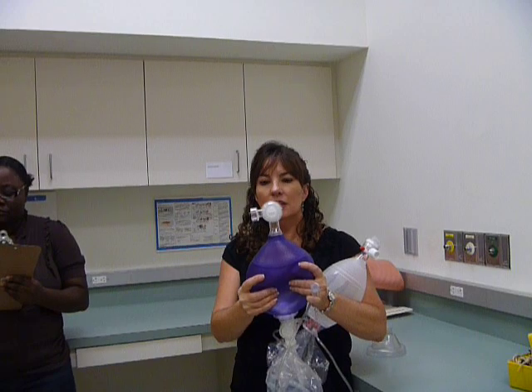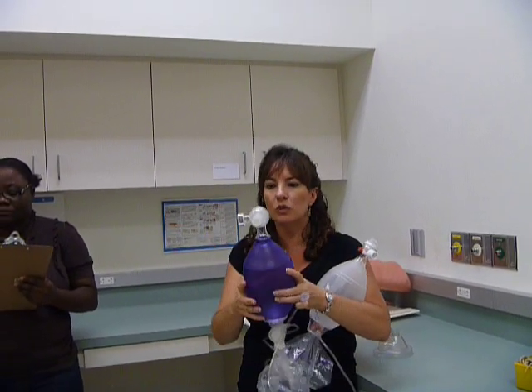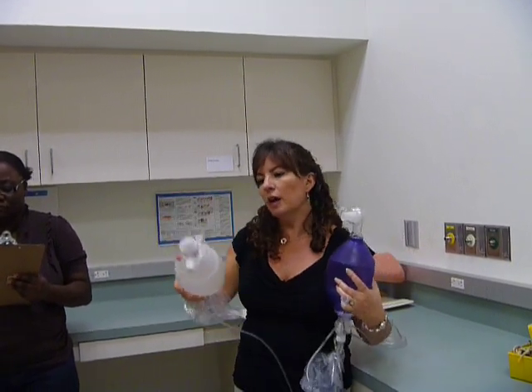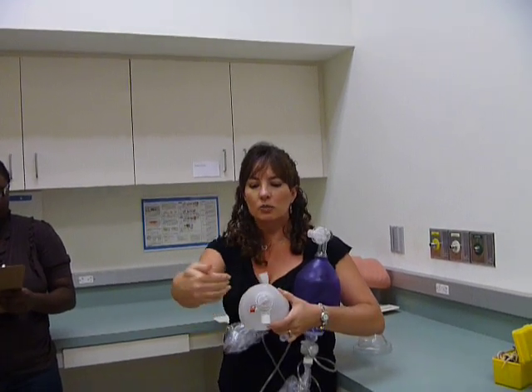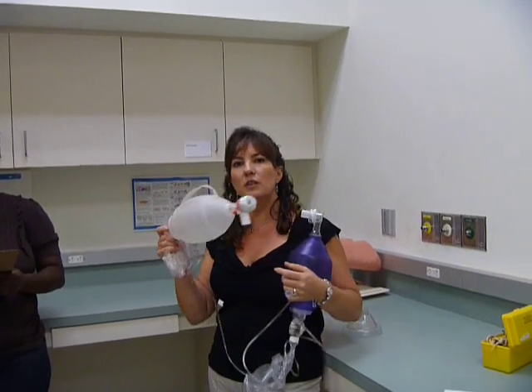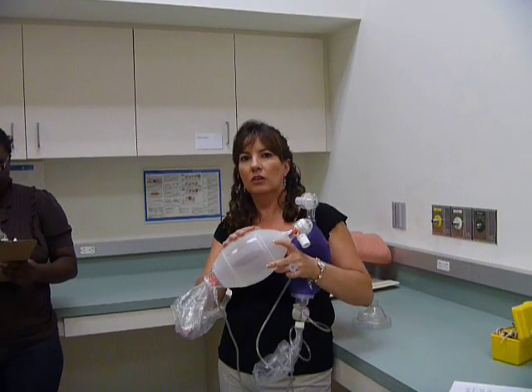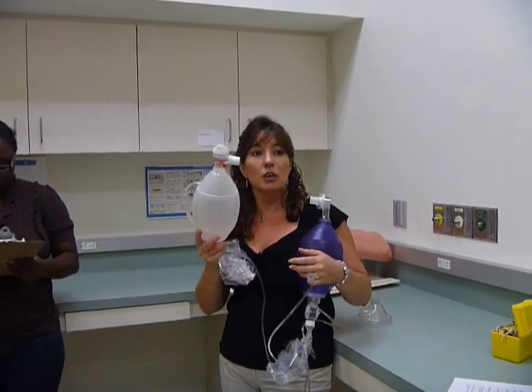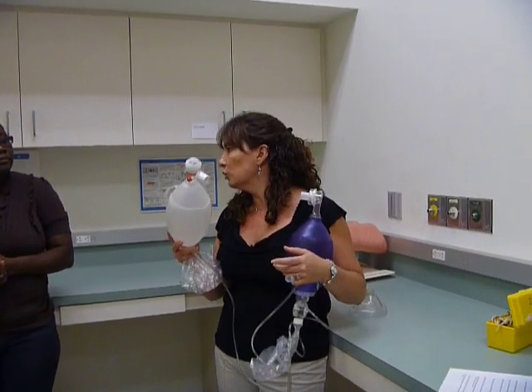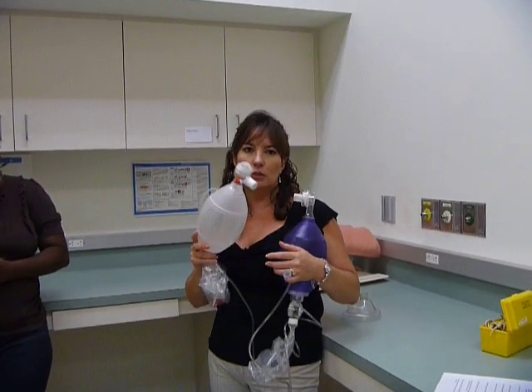When I squeeze, oxygen goes from here into the patient, but it can't go back in — because once I'm done squeezing, the valve closes. With the diaphragm, when I squeeze, oxygen goes this way but it can't come back into the Ambu bag. Why would that be important? You don't want to give the patient carbon dioxide. Right — if carbon dioxide goes in here, it's going to decrease my FiO2. I want this to give 100% oxygen. So if my patient's breathing back into the bag, it's not going to give 100% oxygen.